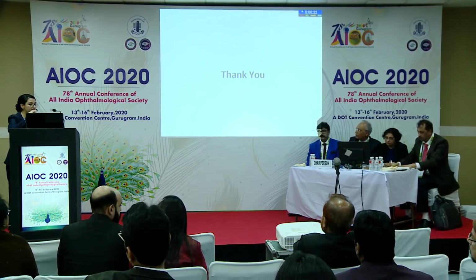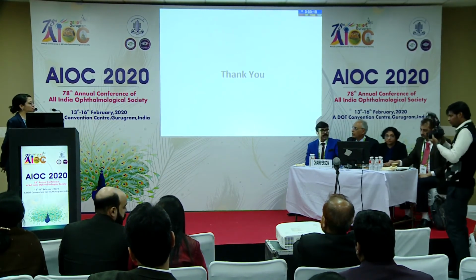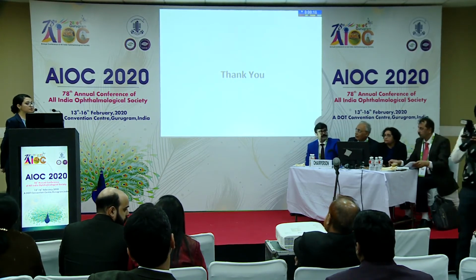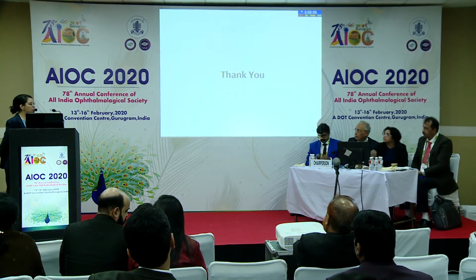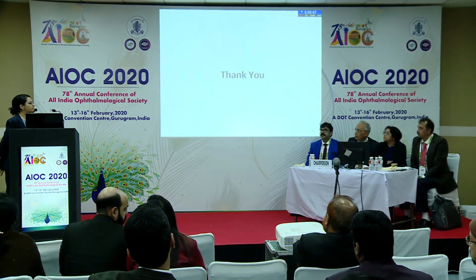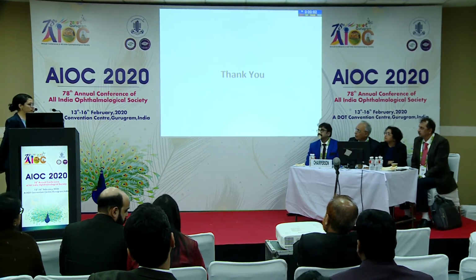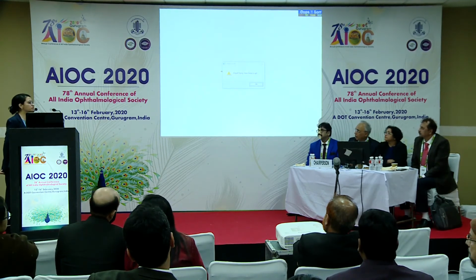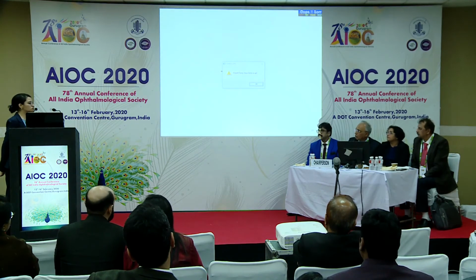Sir, this formula that we have derived is for eyes with cataract with oil in situ. We took the eyes with clear media so that we could do optical biometry and take it as a gold standard, so that we can compare axial lengths measured by ultrasound, regress them, and then we got this new equation. But in patients with cataract, you could do this. It is to be done in patients with cataract in future, sir.